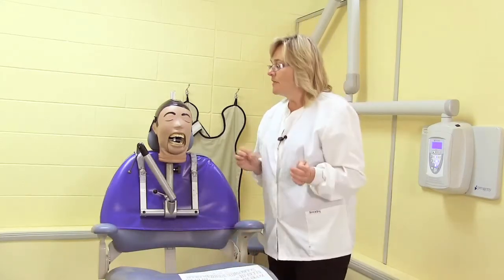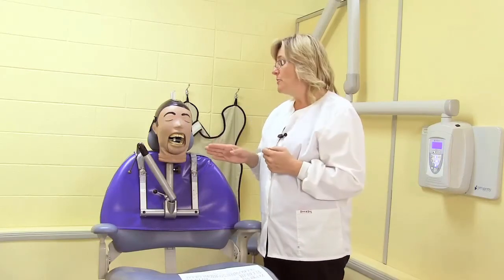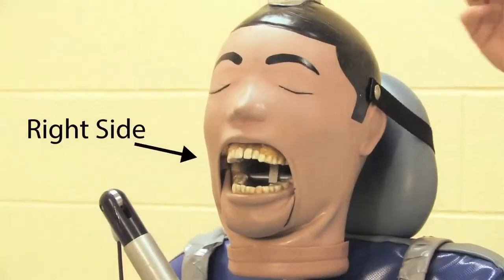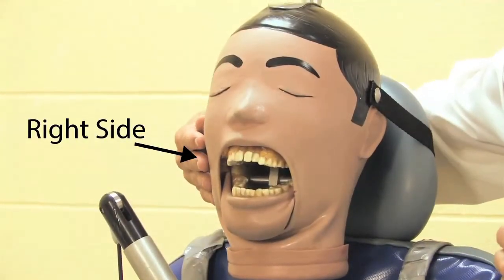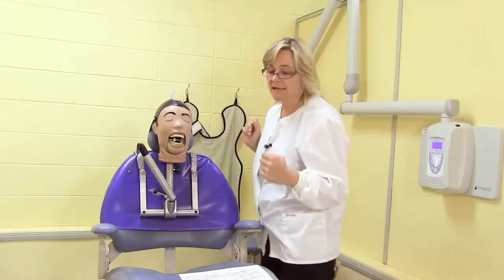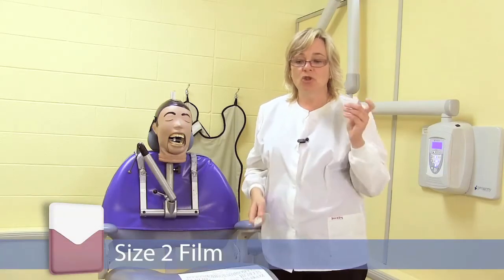So for purposes of today, I will be showing you placement for the anterior bisecting shots and only the right side for the premolar and molar bisecting technique. As we know, in a quick review, for bisecting we use size 2 film.